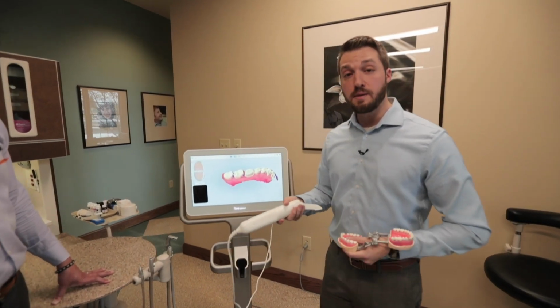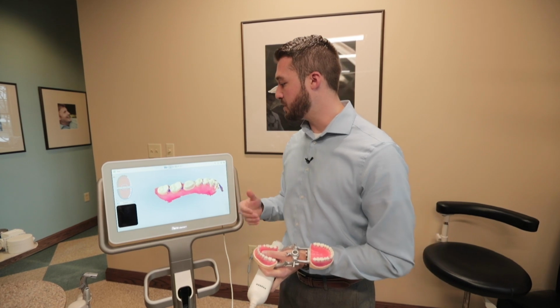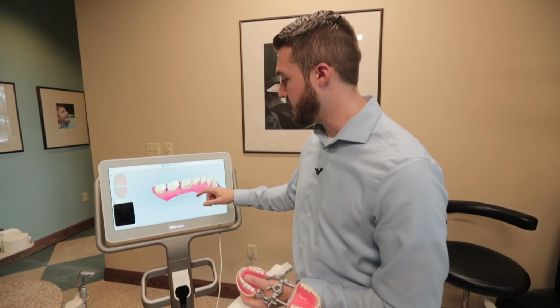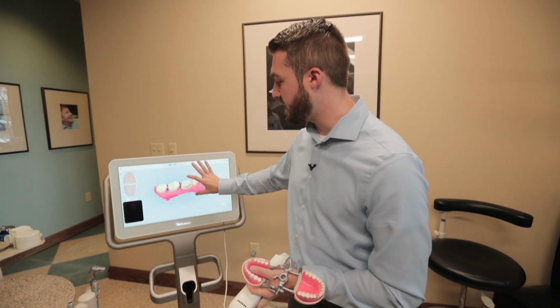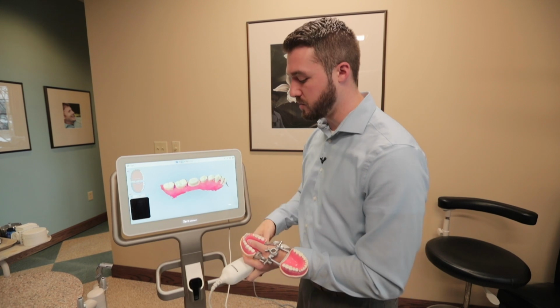So what scanners do is they keep collecting data and building layers. Think about it. You have some saliva, you have some blood, and now you scan over it and you're adding that layer. We want to minimize that and really mitigate the risk of having a literally contaminated scan. So that's what we try to do.